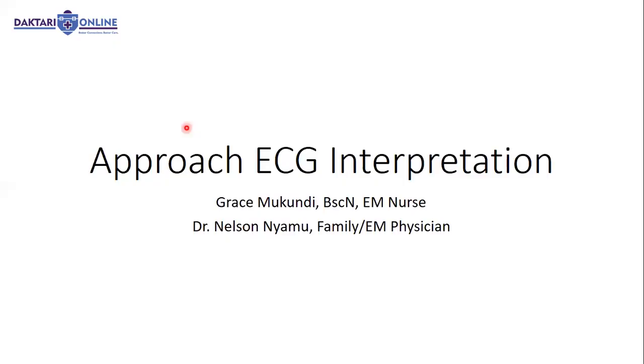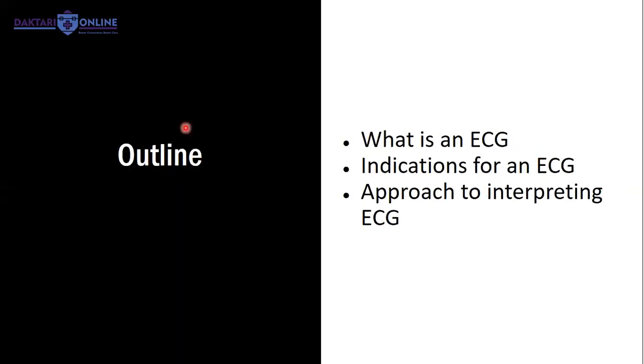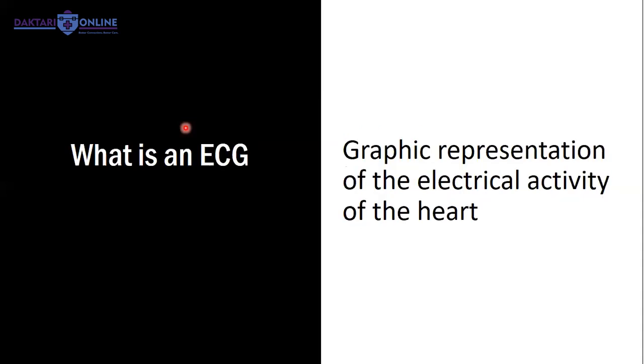All right. So it's a 4-part series organized by Emergency Medicine Kenya Foundation and Daktari Online. Today we are beginning with the approach to ECG interpretation, and being our first one, the first question we're asking is, what's an ECG? And thereafter, what are the indications of doing an ECG? And what's the approach to interpreting an ECG? Very true. All right, and without further ado, Grace, what's an ECG?